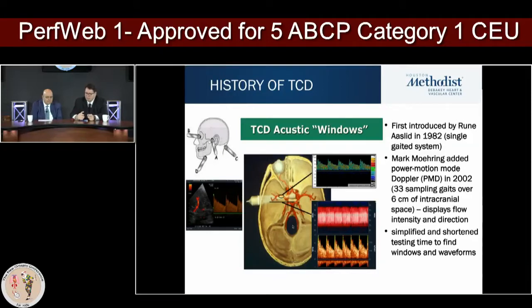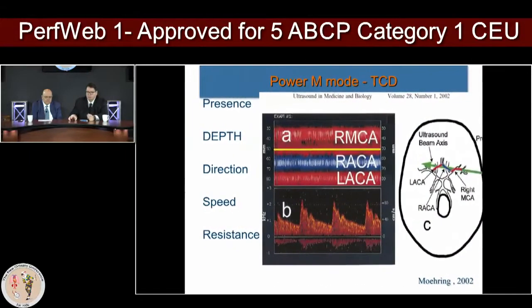And I think the underutilization of the TCD is really coming from the lack of training and lack of understanding how this blood flow really looks like on that ultrasound image. So the ultrasound image, what I'm going to show you today, looks like this, and this is the first publication. On the upper side you see the red signal when the ultrasound signal is coming towards your probe, and these ultrasound signals basically reflect from the red blood cells. So the red blood cells, nice flat surface, give you a nice unique signature, and this is how we can measure the speed of the red blood cells.